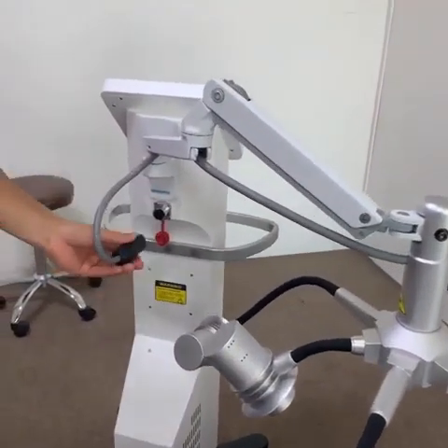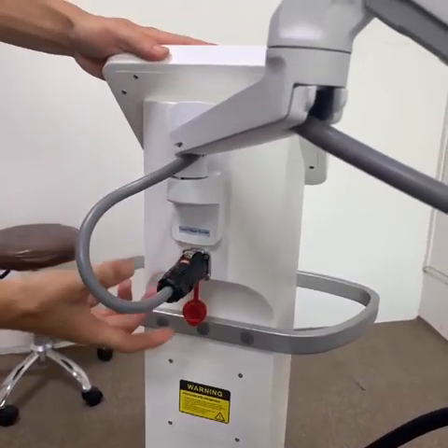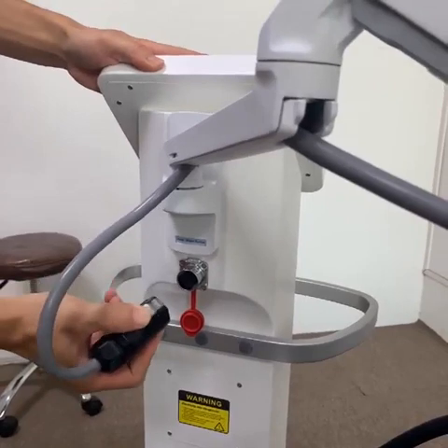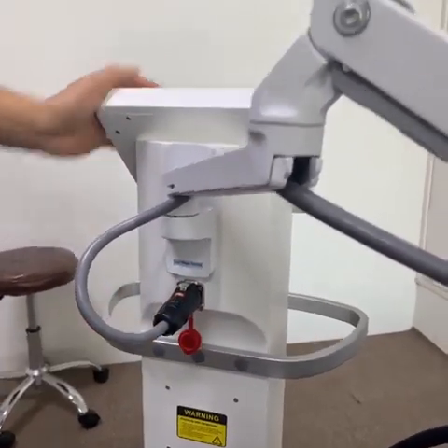And last step, we should install this part to the machine. If you want to remove this part, press the silver button and then take out.